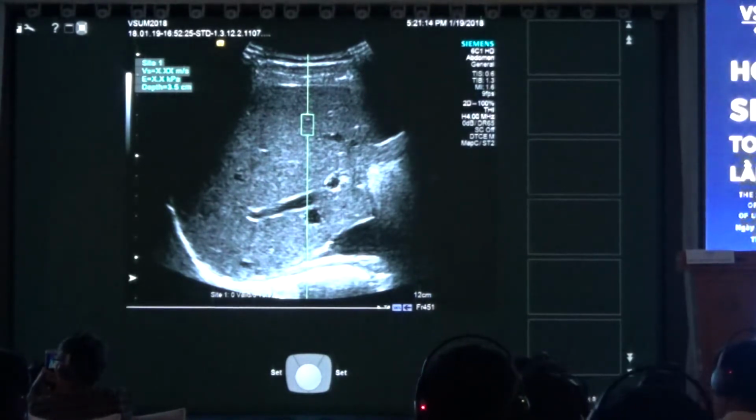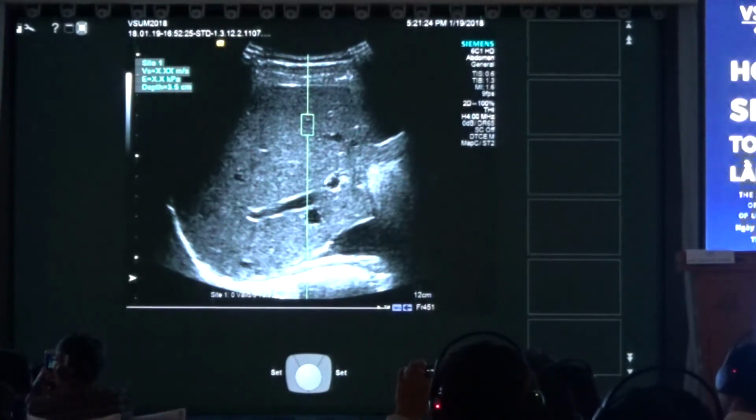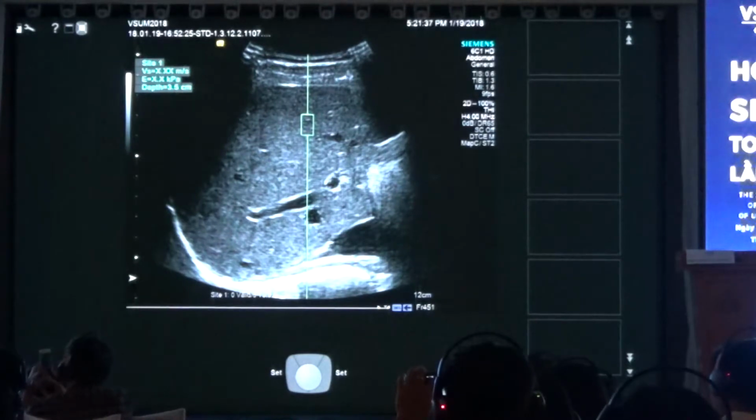So the idea is, if I measure, I'd like to have 10 measurements of one respective point in the best value. So I stay in one line and do my 10 measurements. If I believe it's heterogeneous, I take a second point and do 10 measurements and see how it differs. So that's a way of doing shear wave elastography.